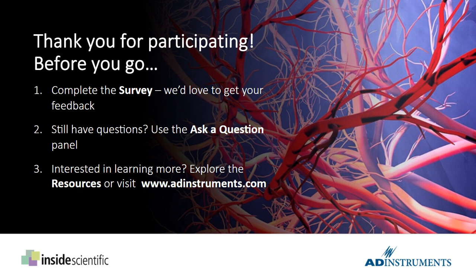And there is work, albeit less work than for 2-point or segmental pulse wave velocity, but there is work showing that these local estimates do have some clinical implications, similar to 2-point pulse wave velocity as well. So there is some capacity for clinical use and meaning, but more work does need to be done in this area. Yeah, of these, clinically, the carotid is most useful and is very highly related to stroke risk.